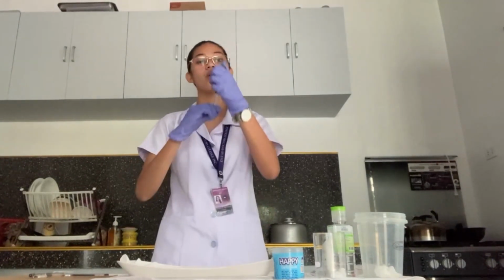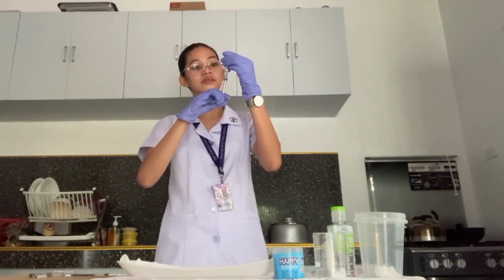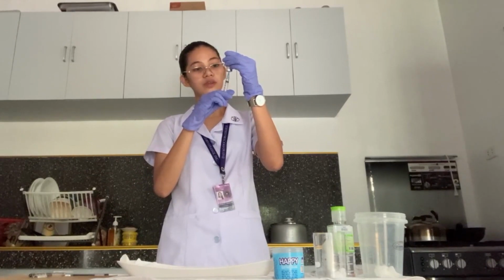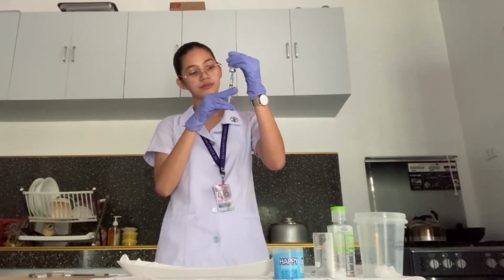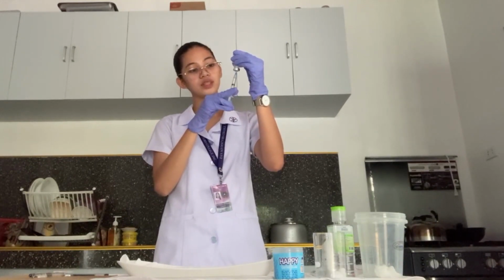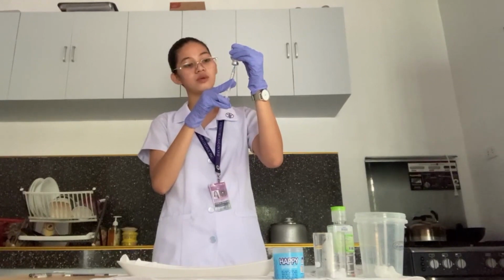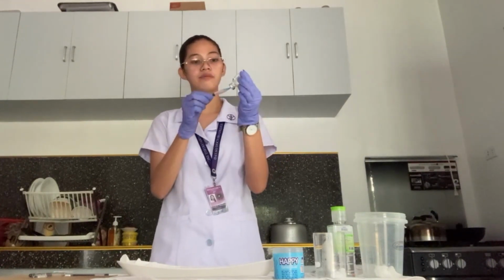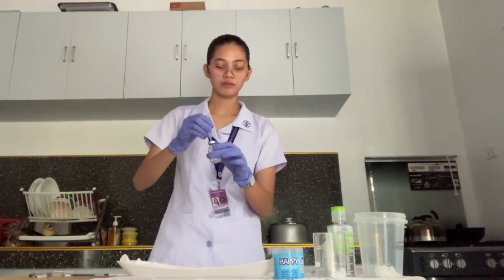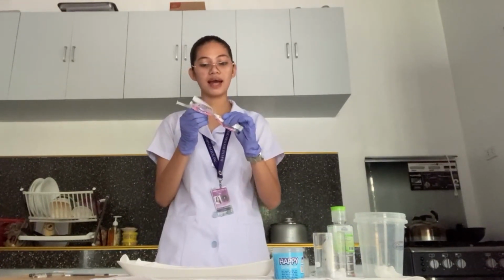And then tilt or invert the vial, and then we're going to withdraw medication up to the same amount of the air that was withdrawn. Okay, for that, we're going to grab the cap and then recap it back.